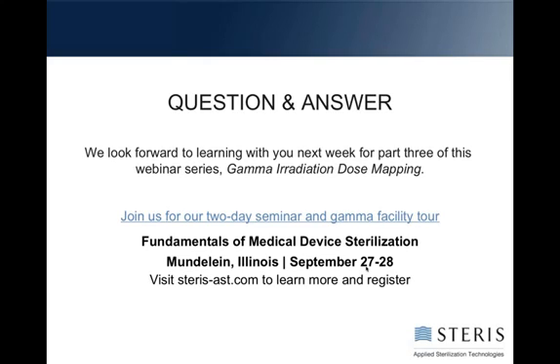All right, on table 9 for VD Max 25, starting at 120 CFUs per item, the verification dose starts going down instead of up. And they're asking, can you explain the reasoning for this better than the ISO does? The best way to look at that is, when you get to 25 and 1,000 CFUs, take a look at the method 1 table for 1,000 CFUs, and you will find that that number actually is the same. They have to give you the ability of those two tables to converge, so the mathematics of that slope starts to come back down.